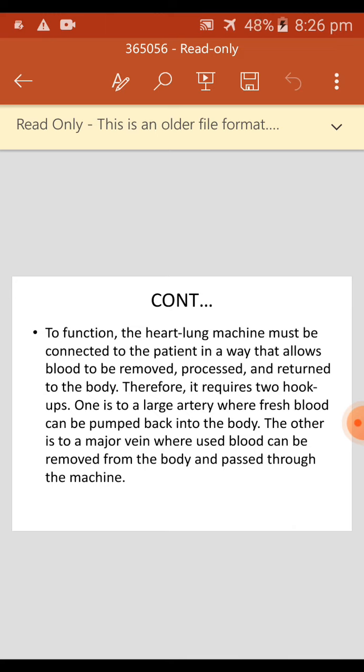Cardiotomy reservoir. The function of the cardiotomy reservoir is, first, it collects and filters the blood aspirated from the operation area and feeds it back into the ECC as required. Second one, provides volume storage.